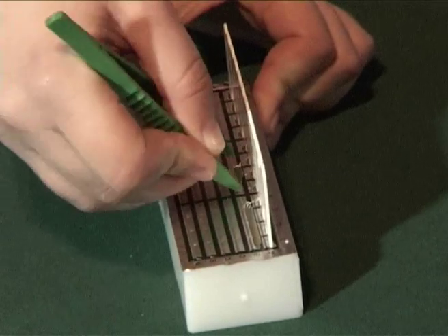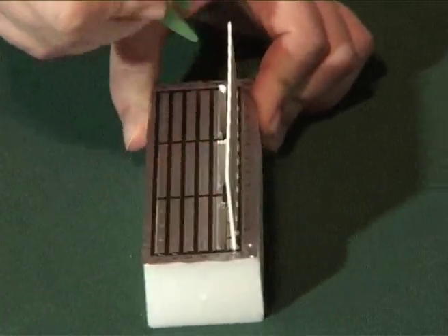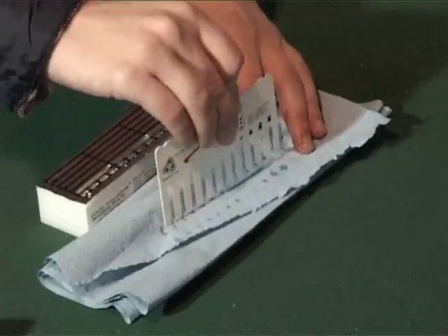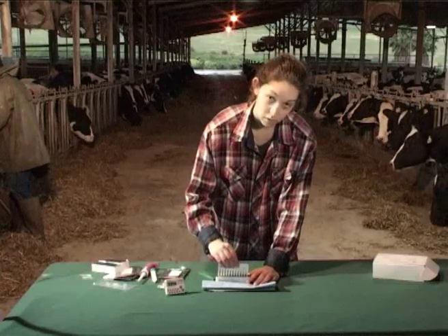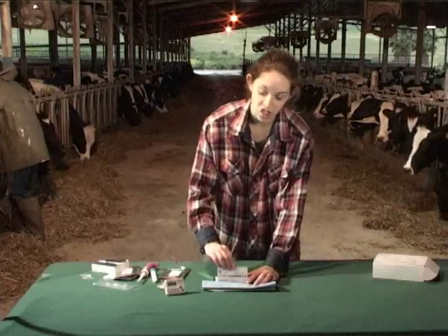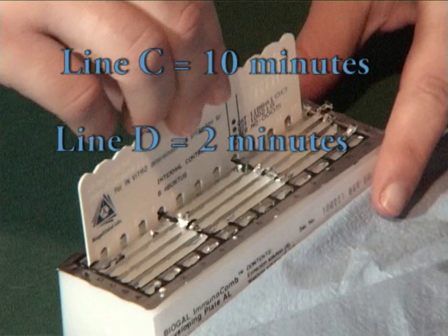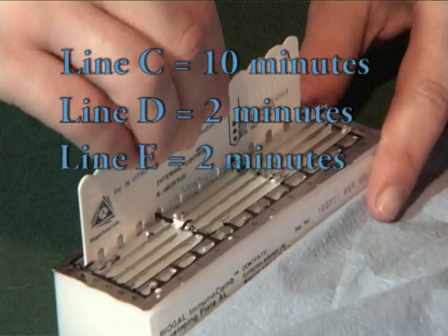Punch line B, remove the comb from line A, and remove the excess liquid using a piece of paper. Dip the comb in line B and proceed in the same way as in line A, and so on to complete the process.